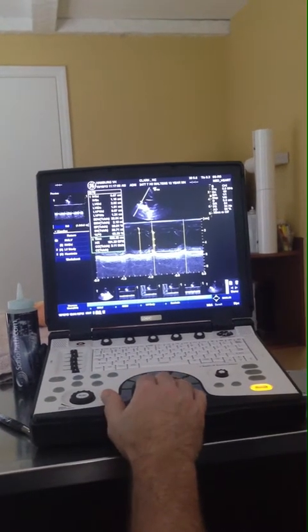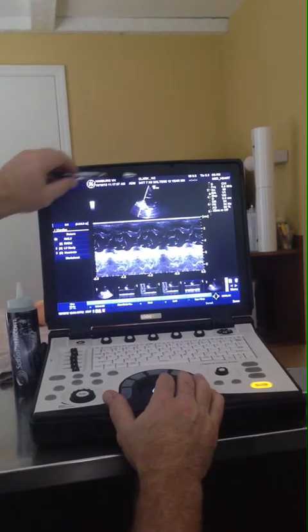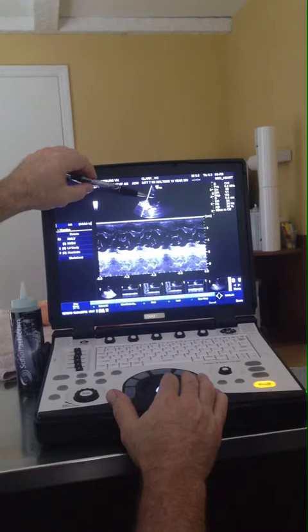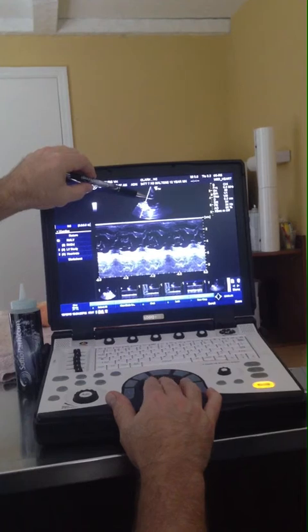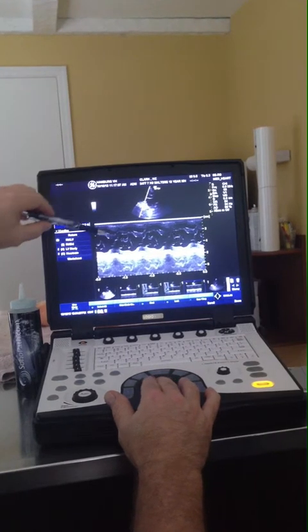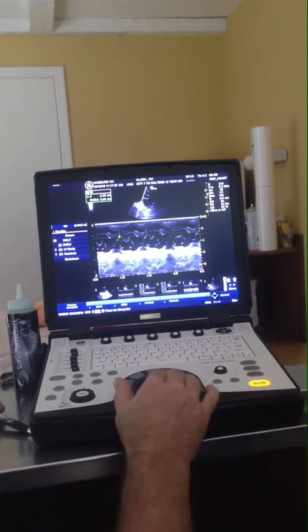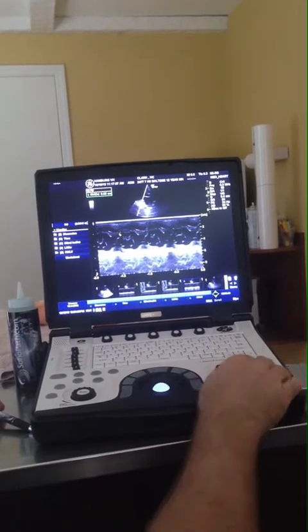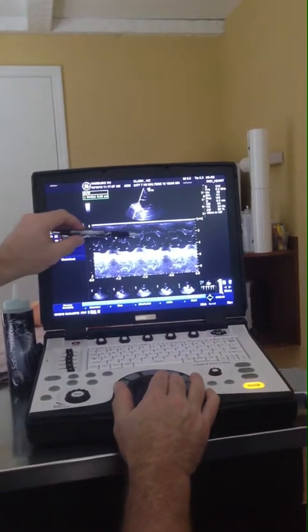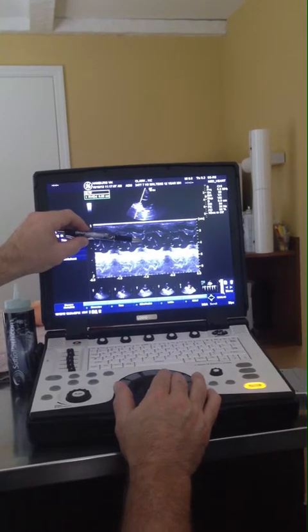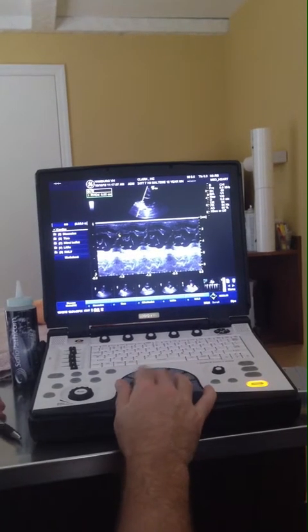This next measurement is EPSS. I look at my M-mode and see that I'm going through the septum pretty perpendicularly, and I'm catching the anterior leaflet of the mitral valve. Looking at the best one, you can see the anterior leaflet of the mitral valve is touching the septum, so technically the EPSS should be essentially zero. If this were a DCM case, there would be a wide space between the septum and the mitral valve anterior leaflet, which is typical of DCM.